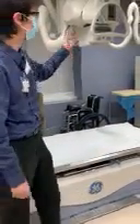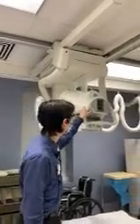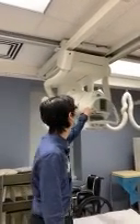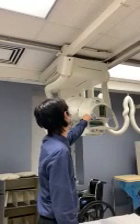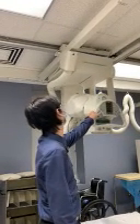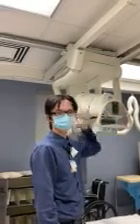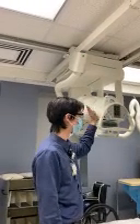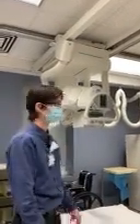As always, anytime you're working the table bucky, make sure to turn on your detent, and then make sure to lock yourself in laterally, wherever that is. Good. You do not need to lock yourself in longitudinally, right? Because instead you're going to take the tube and just line it up to your bucky once you're ready.